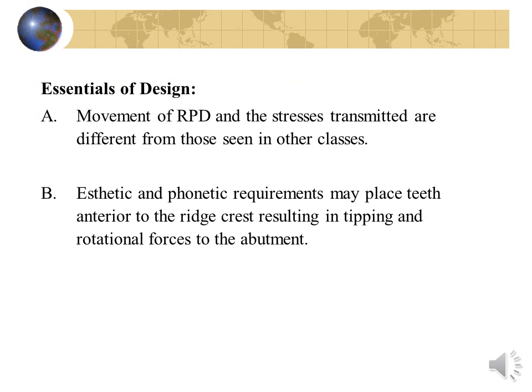Movement of the removable partial denture for Kennedy's Class 4 arches and the stress transmitted are different from those seen in the other classes. Aesthetic and phonetic requirements may place teeth anterior to the crest of the ridge, resulting in tipping and rotational forces on the abutment.